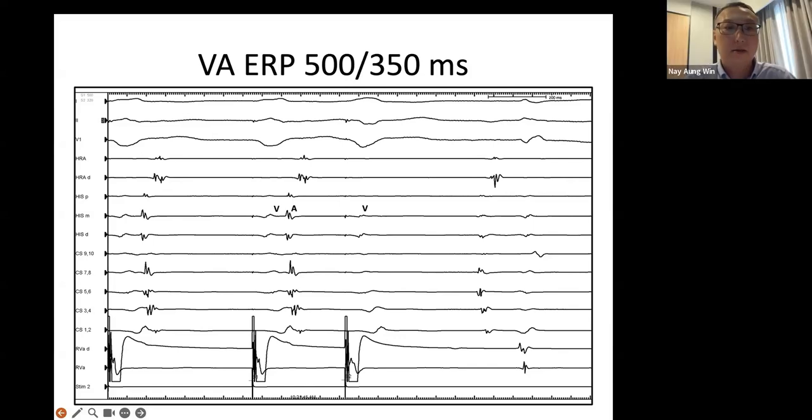Okay. So this patient has dual AV node physiology capable of a single echo. That rules out what? Septal pathway, the earlier question you had. What else? Septal atrial tachycardia as well. Okay. All right.